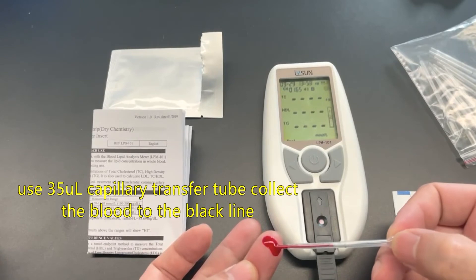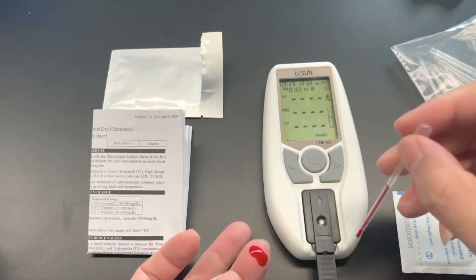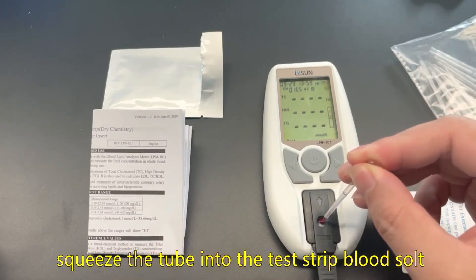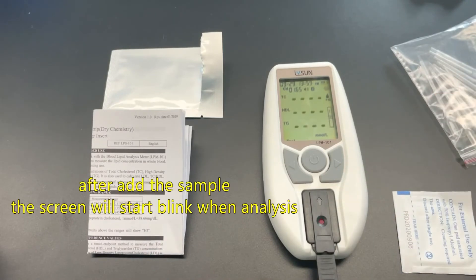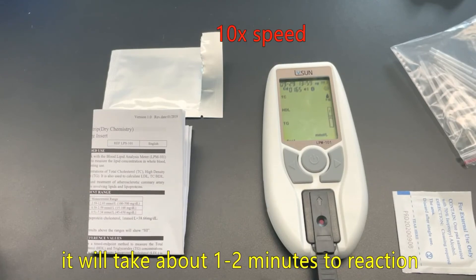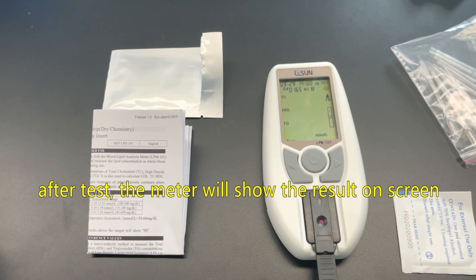Use the capillary transfer tube to collect the blood up to the black line. Squeeze the tube into the test strip blood slot. After adding the sample, the screen will start to blink during analysis. It will take about one to two minutes to react. After the test, the meter will show the result on screen.